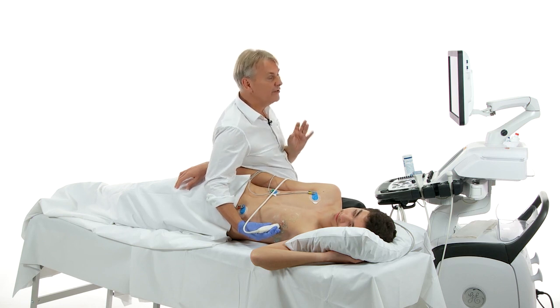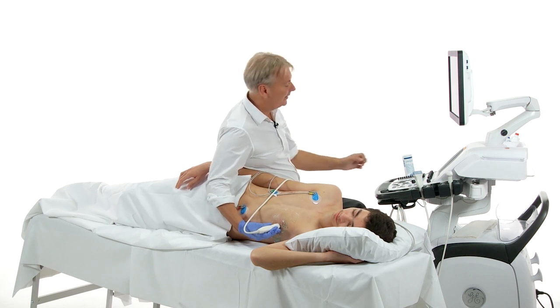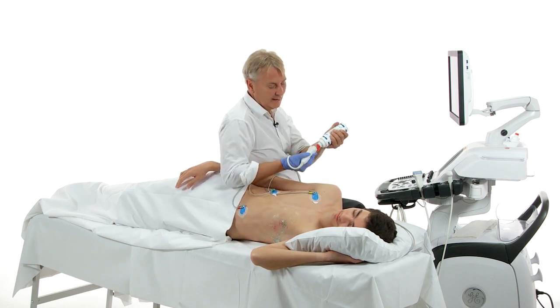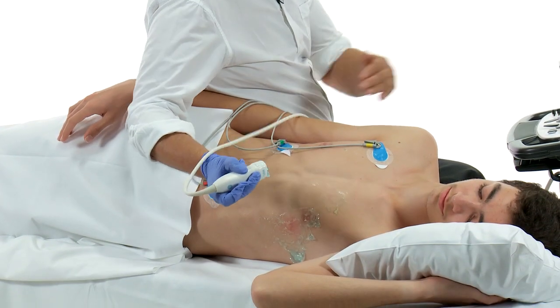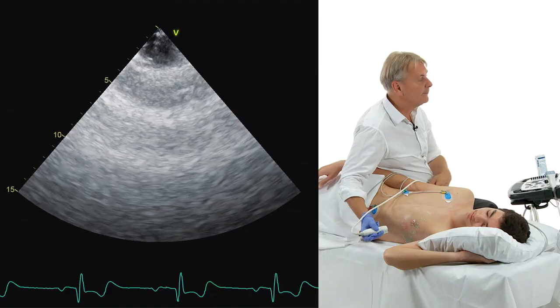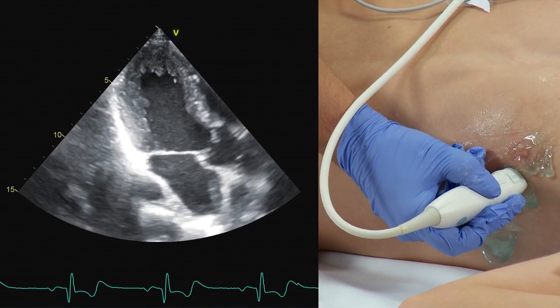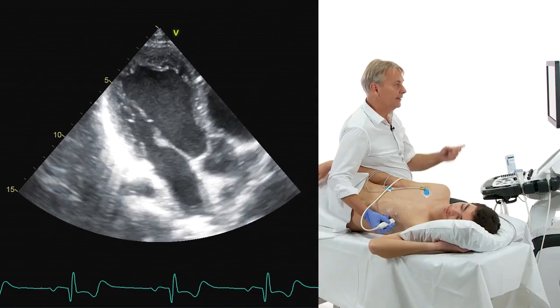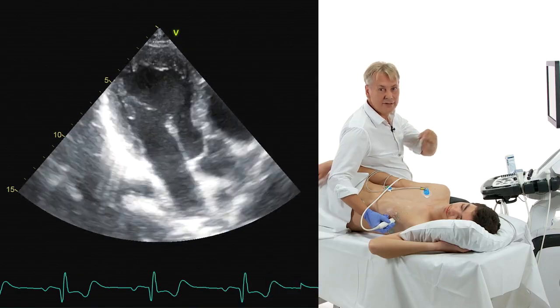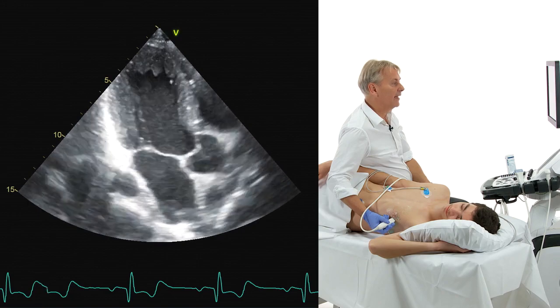In reality, it's very simple actually to just use a one placement strategy to demonstrate the three-chamber view. How do you do that? Well, take the transducer and put the thumb on the marker and point the marker to the right shoulder and simply place it on the chest. There you have it. This is the three-chamber view without using the rotation technique. I actually find this a lot easier. The disadvantage here is that you do not scan the region between the two and the three-chamber view. So both approaches can be used combined.